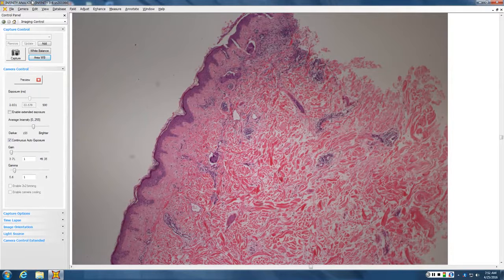There are a few lymphocytes around. That has nothing to do with the name inflammatory. Inflammatory doesn't mean histologic inflammation. It means clinically it's pink to red. Looks kind of like erysipelas or cellulitis. And you will see it, and you will see it not uncommonly in practice. It is typically a worried 35 to 45-year-old woman who's post-mastectomy, and the breast is just kind of pinky red, and her surgeon's telling her it's nothing, it's okay, and she's worried, she knows it's something.